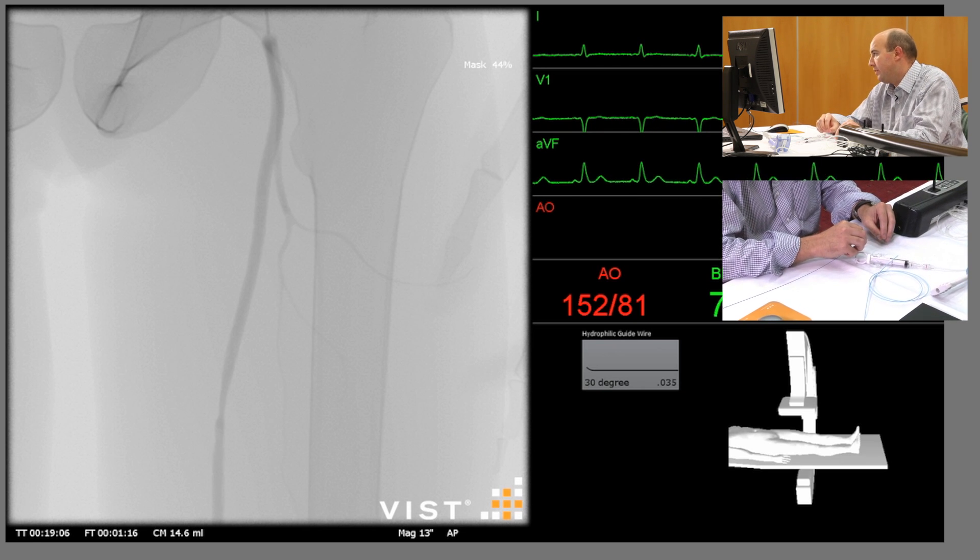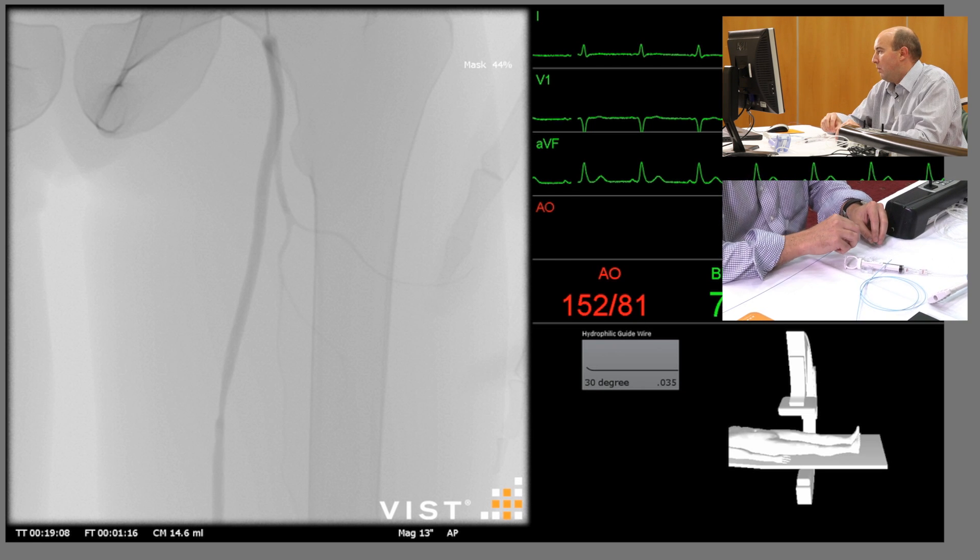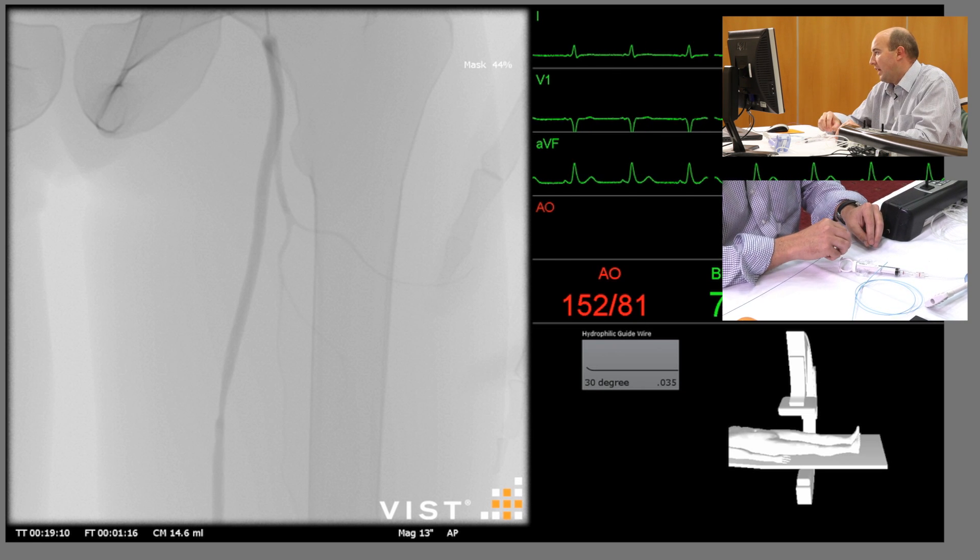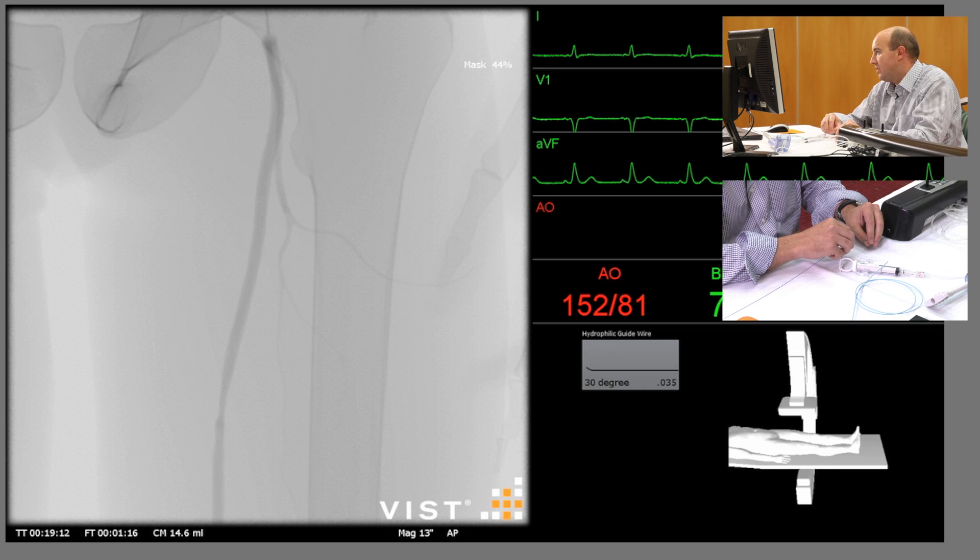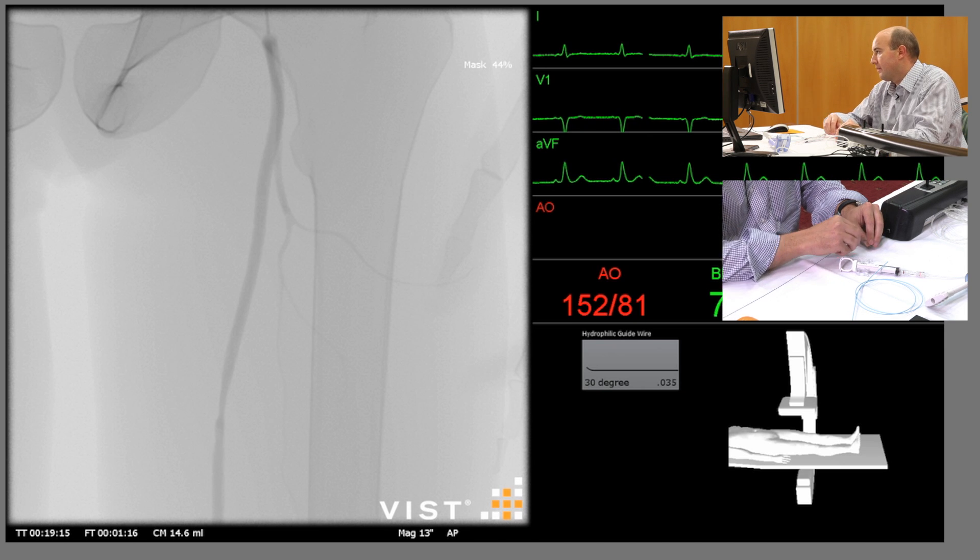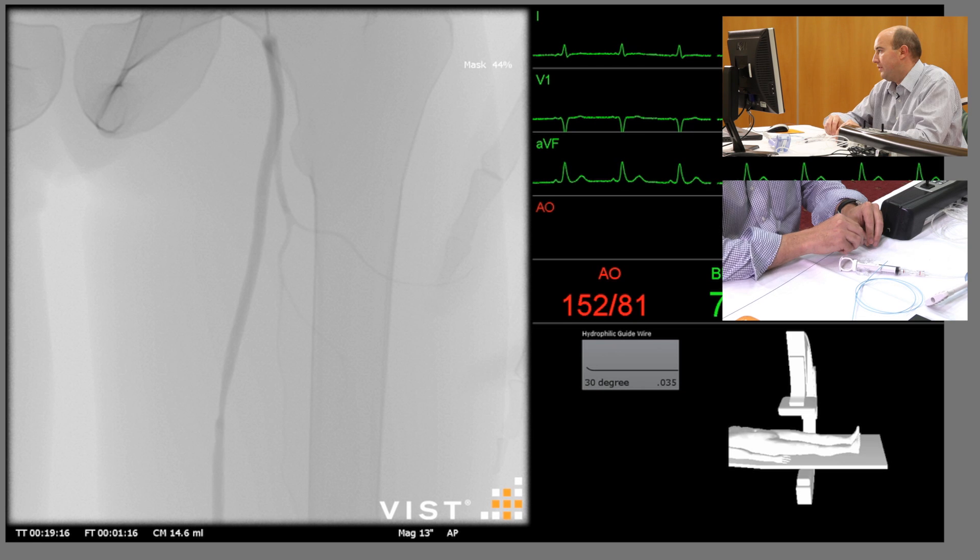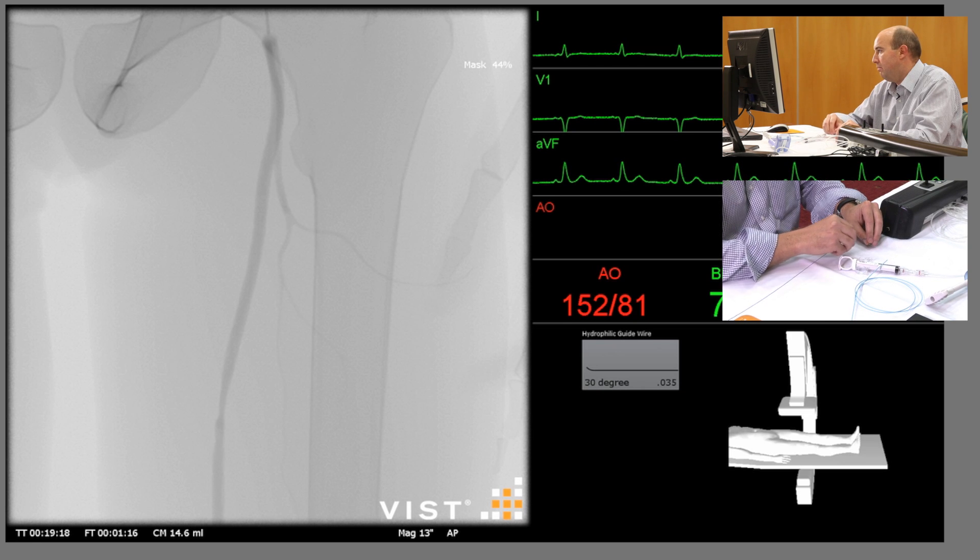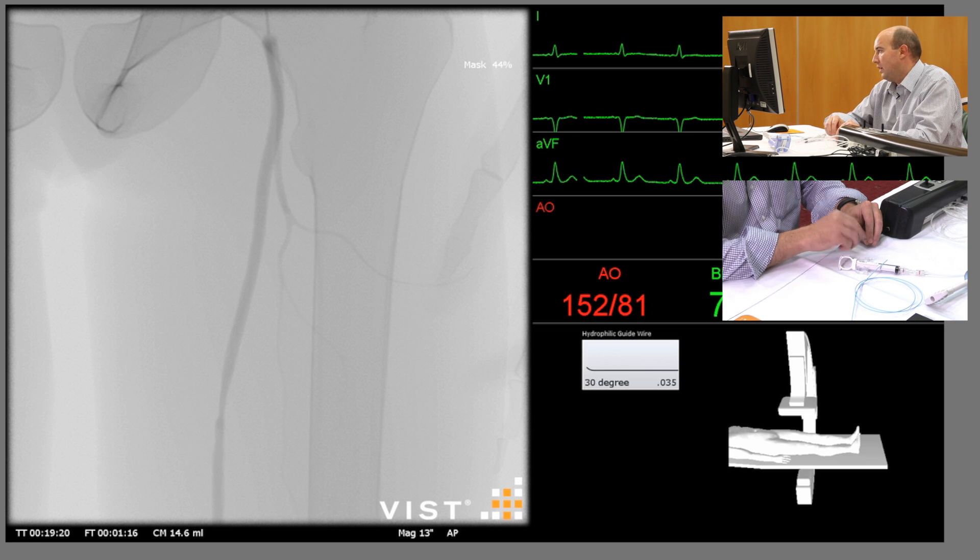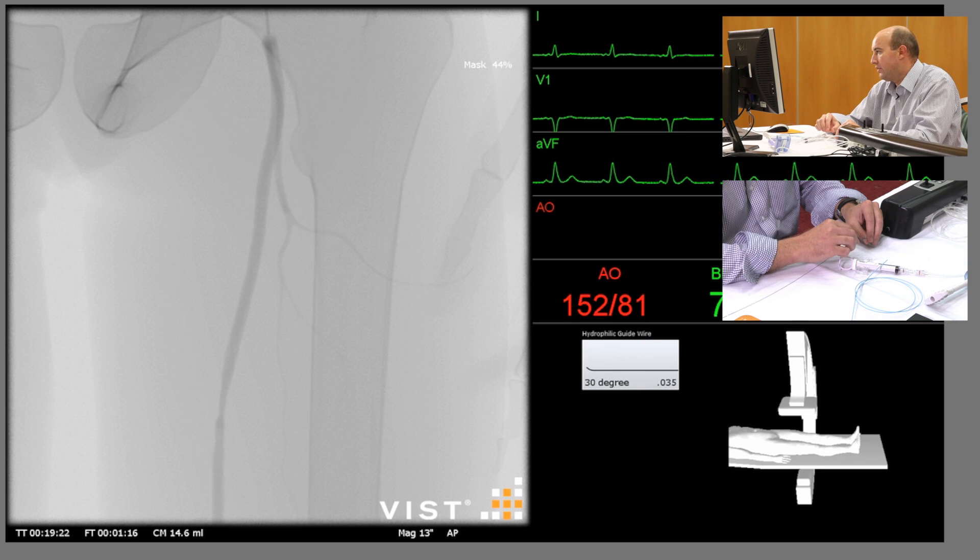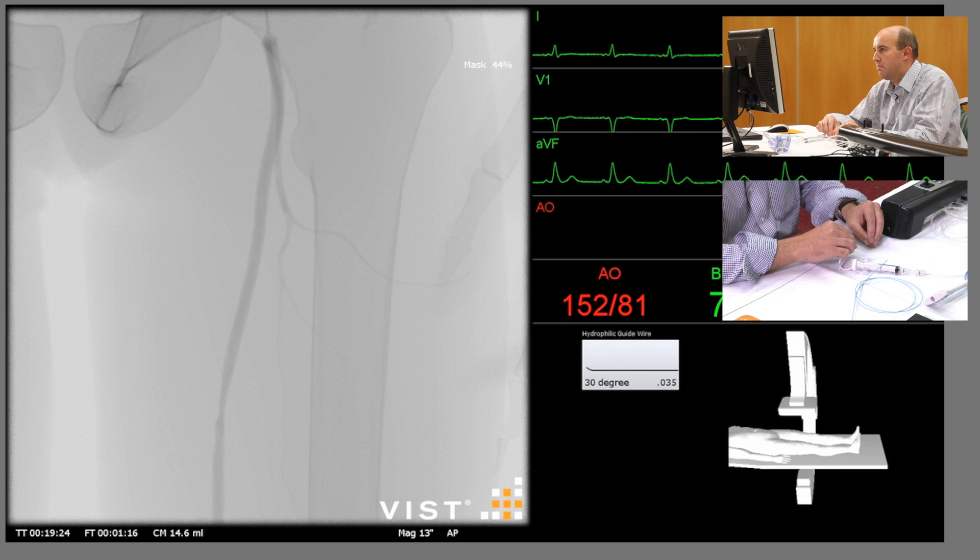If you look at the right-hand monitor underneath the blood pressure in the red, you can see a 30 degree wire selected. Once that lights up, that will show that it's engaged in the system. It's not currently lit up, and you have to feed a bit of wire in before it does so.